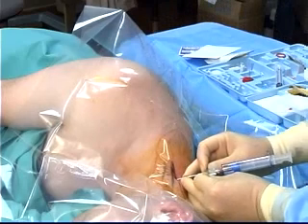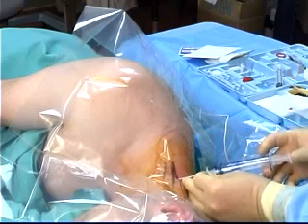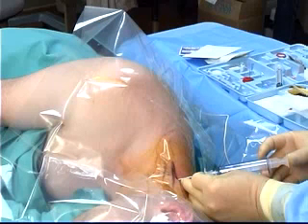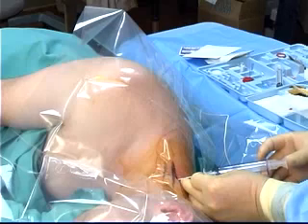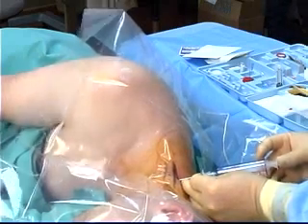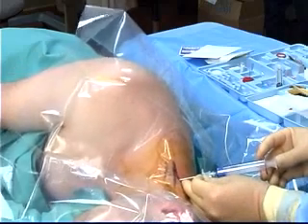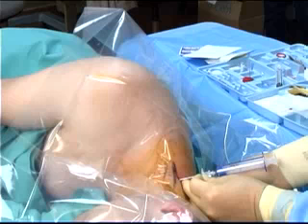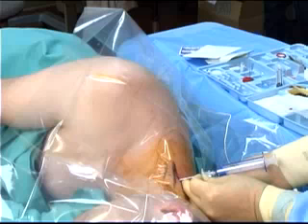After walking off these bony structures, the needle is advanced carefully in an anterior direction, remaining on the plane of the line between the dorsal spine of C6 and the suprasternal notch. Loss of resistance to air will be encountered simultaneous with a motor response. The muscles involved are usually the triceps, biceps, deltoid, or major pectoral muscles, but any muscle group of the upper limb would be acceptable for this block since the needle is now in contact with the posterior aspects of the roots of the brachial plexus.